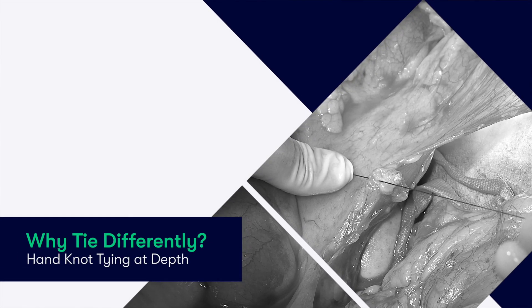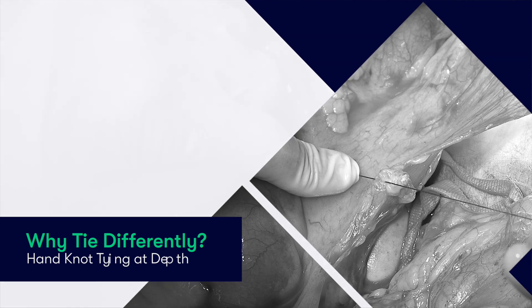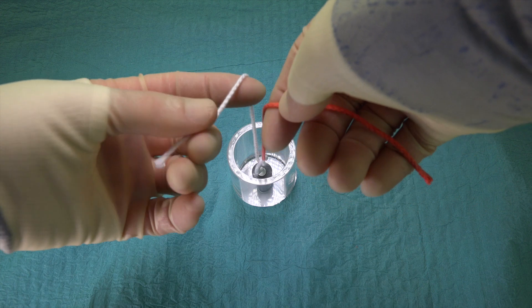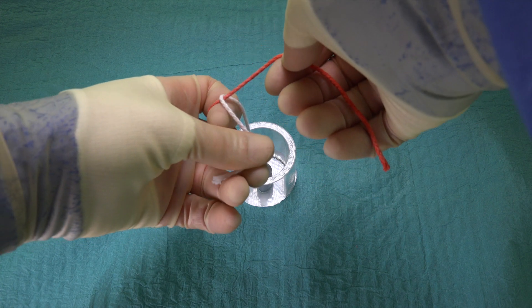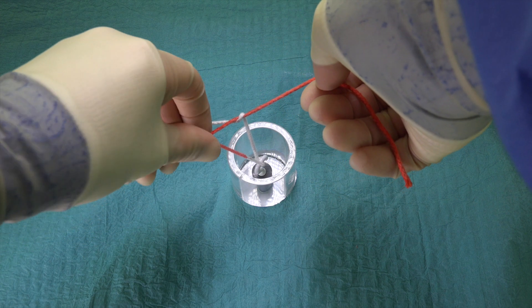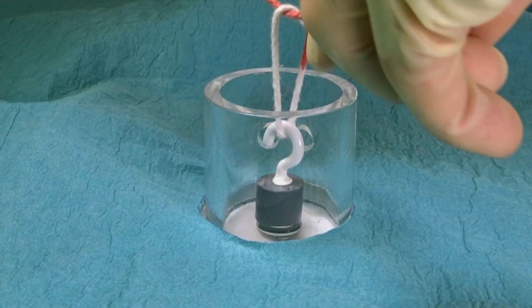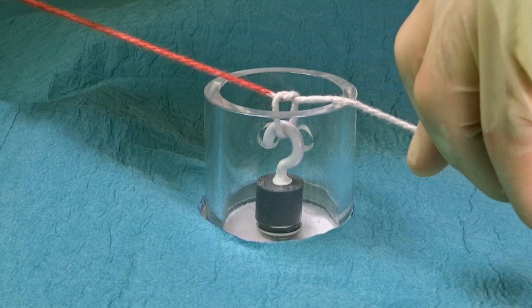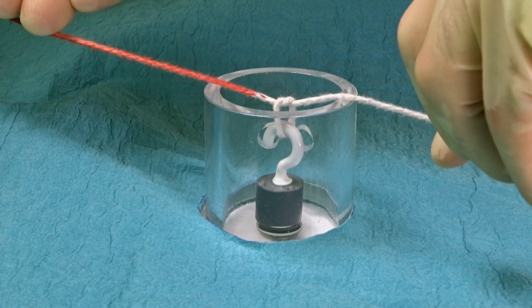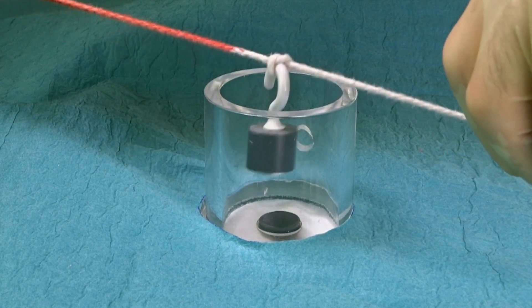If we were tying a blood vessel lying deep within the abdominal cavity, and we use the same technique of crossing our hands horizontally with every throw, as we do when we perform a simple reef knot, we would run the risk of creating too much tension on the vessel which may cause it to tear and bleed. In this case, the excessive tension causes the metallic hook to be pulled off its magnetic base.